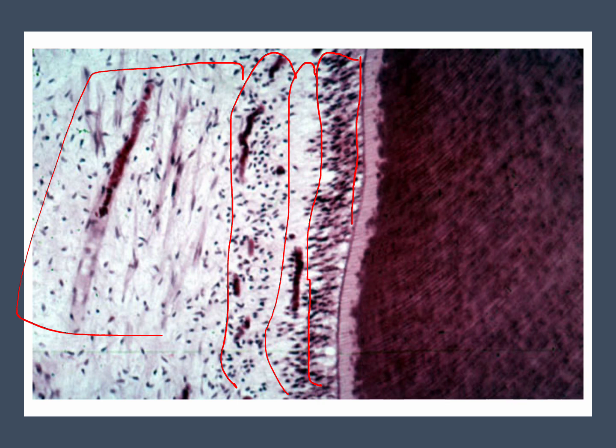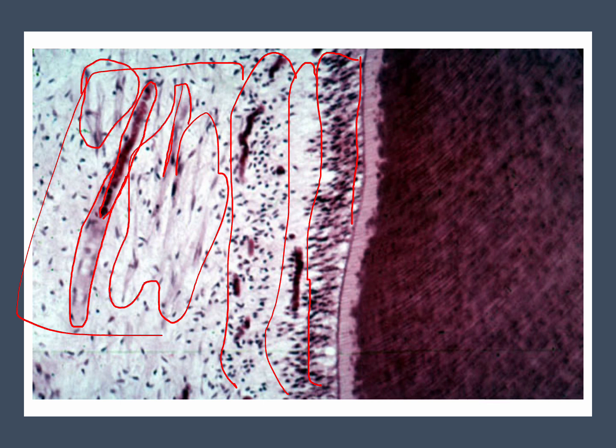As you can see here, there are some structures inside. They are cut in longitudinal section. Of course, you can see the blood cells inside the structure. This is a blood vessel, but it is coming together with a nerve bundle that looks like woven wool. As I have said before, look at these structures. All of these are light dark purple woven structures. These are nerve fibers, and all of these structures that have red blood cells inside them are blood vessels. They are all cut longitudinally.